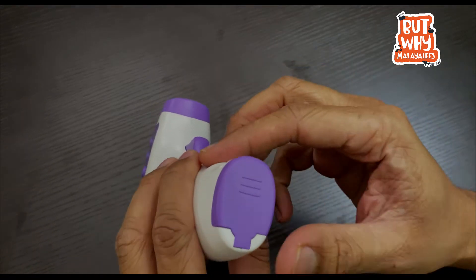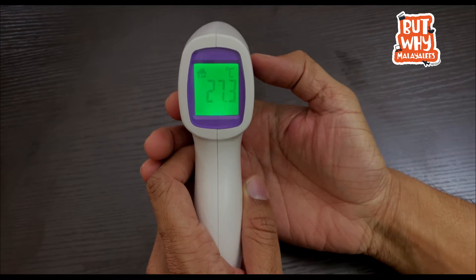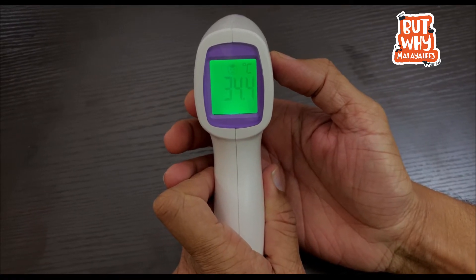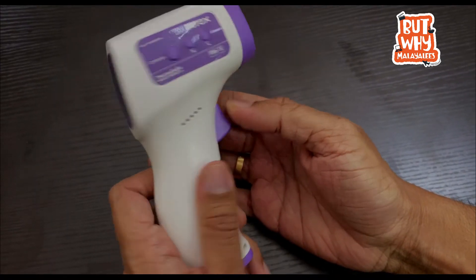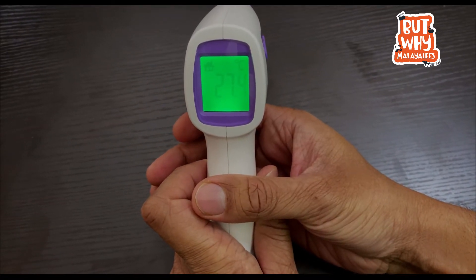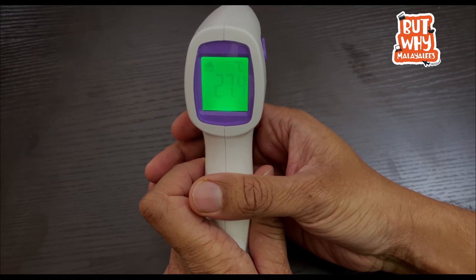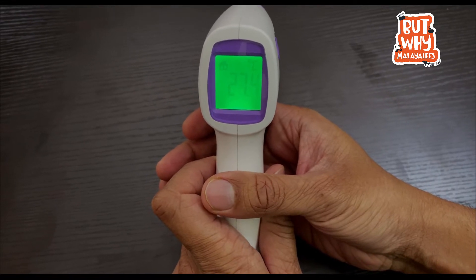This is the trigger button — the temperature button. I am going to press the temperature button. Within 3 seconds, we can see the temperature. The temperature in Bangalore is 27 to 30 degrees. Reading shows 27.4 — the accuracy level is better.